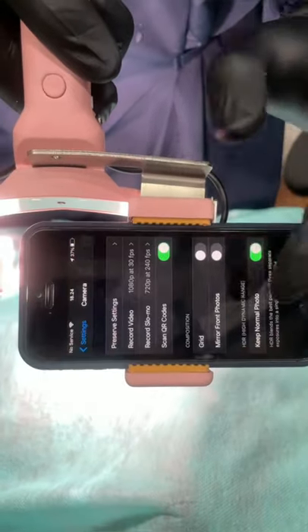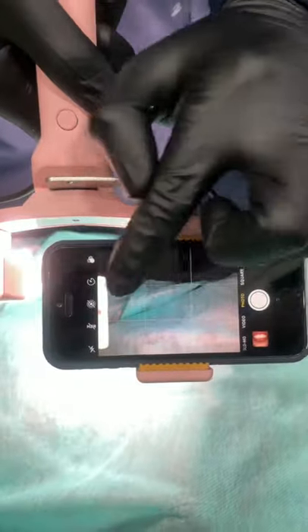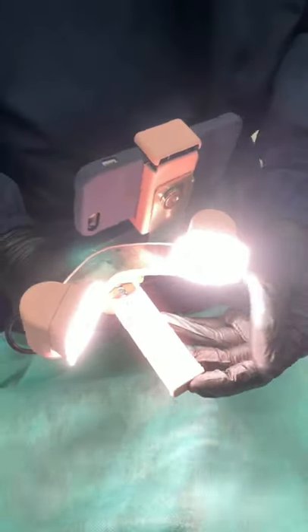Okay, now go to the settings and activate the grid on the camera. Now you will see the lines — you have a guidance for you.